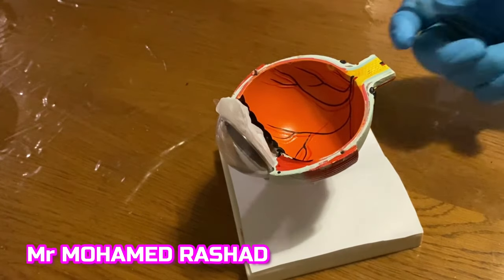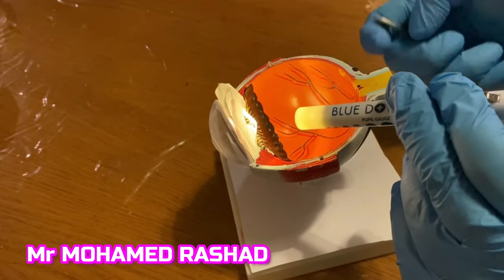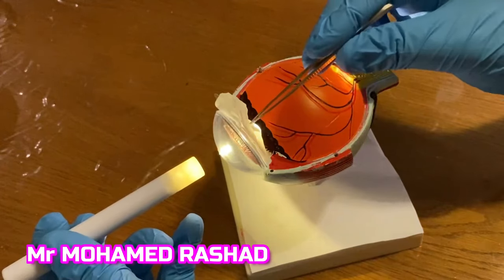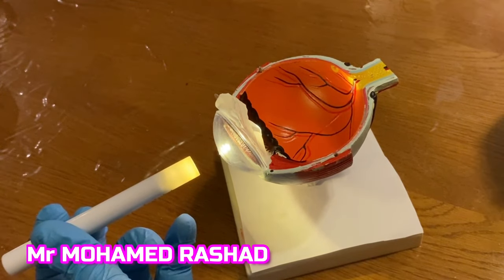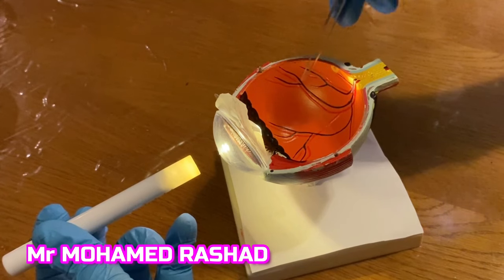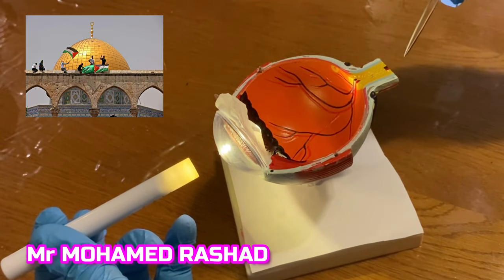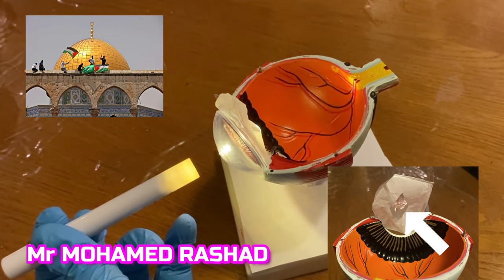After the YAG laser posterior capsulotomy, we have made an opening in the cloudy membrane that forms behind the lens. This cloudy bag has now been cleared, and when the light shines in front of the eye, it can be focused by the artificial lens on the retina and the image is transmitted through the optic nerve, so the patient can see a clear image again.